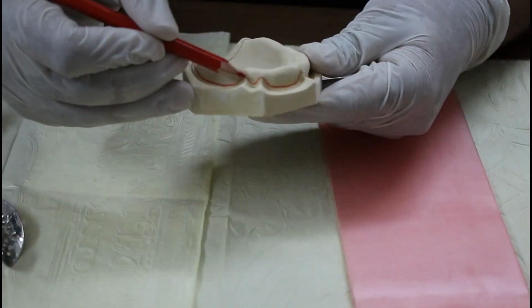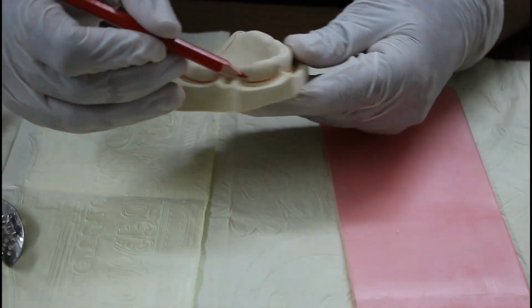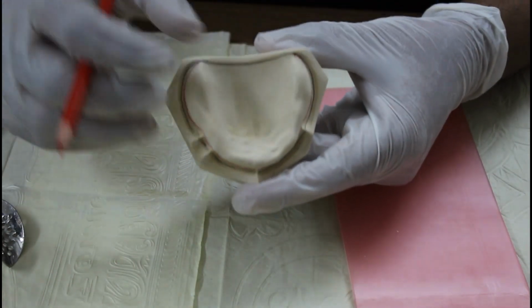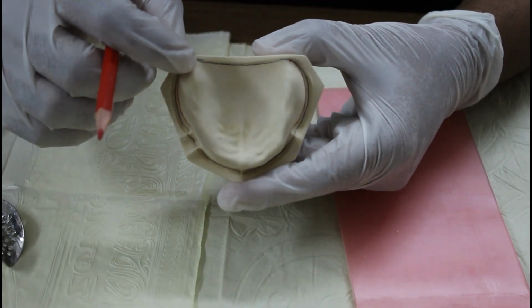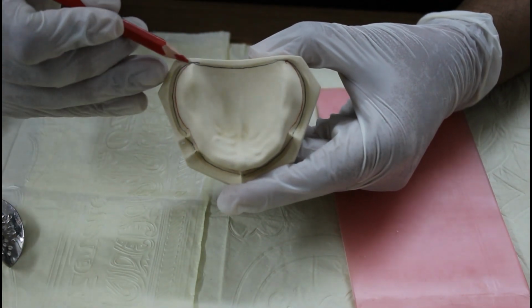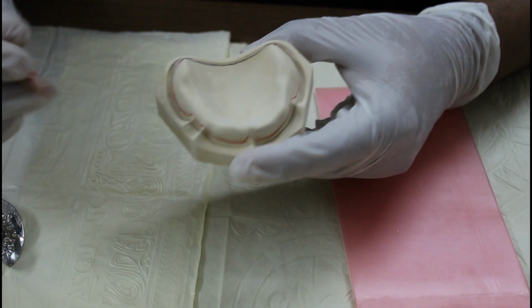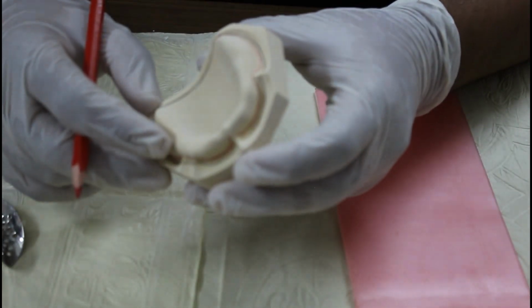See here carefully now. Can you see here? It is 2 millimeter above. It is going up with the frenum, going down into the sulcus, going up with the frenum. At the posterior end, it is ending in the hamular notch. Okay, so this is the second line.